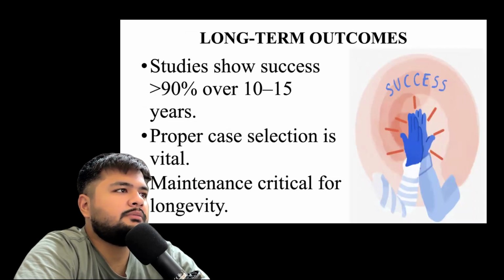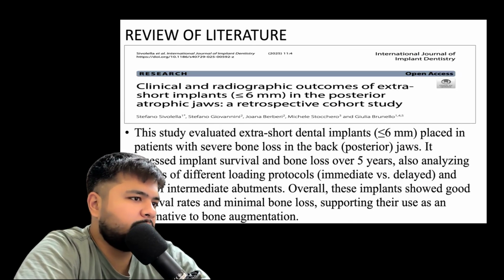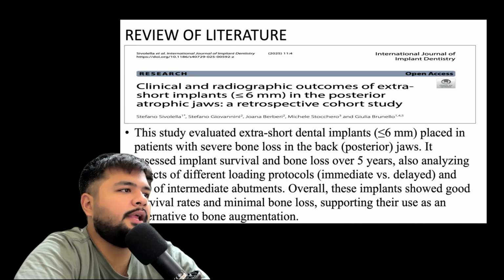Then long-term outcomes. The study shows success of more than 90% over 10 to 15 years. Proper case selection is vital. Maintenance critical for longevity. Coming to the review of literature. So I have added 7 to 8 articles in short explanation, and two major articles I have presented as a journal club here. So those are both in detail.